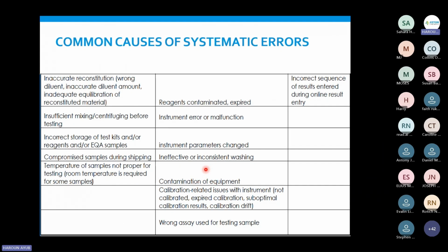It will alert you. So those are alerts that we usually say, when you have failed your EQA and you ran the EQA on the 18th, go to the history of your analyzer and check if there is any historical data of errors or malfunction during that particular day. Because if you see pipette error, you know pipetting was affected. Clot error, it means that the pipetting of that particular sample was not correctly done and so on. No water in the instrument, and this.